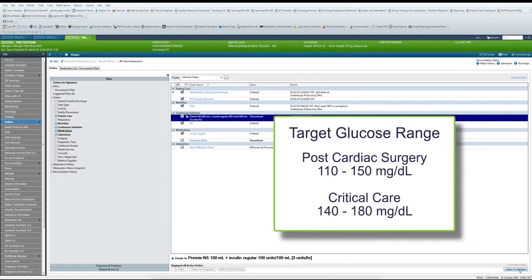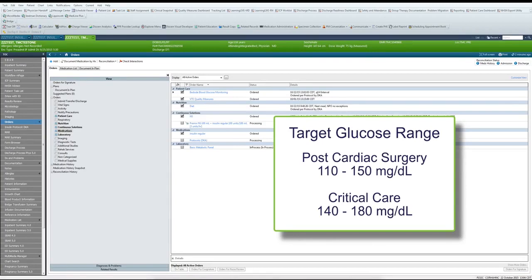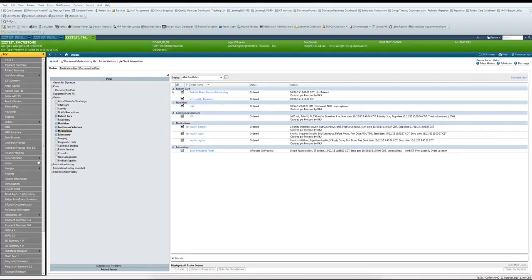Hyperglycemic hyperosmolar state, or HHS, functions similarly to diabetic ketoacidosis, except the target glucose range for dextrose administration is less than 300 for HHS and less than 250 for DKA. The transition logic for the HHS advisor is based on serum osmolality, unlike DKA, where the requirement is the closing of the anion gap.